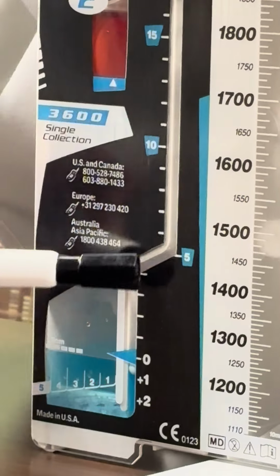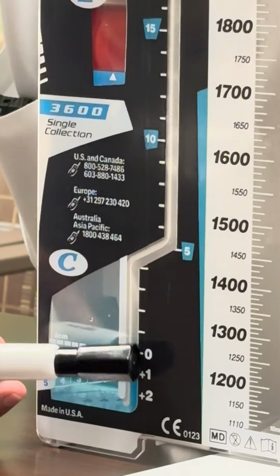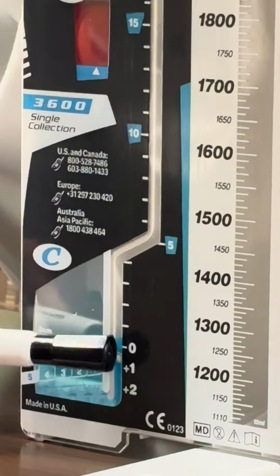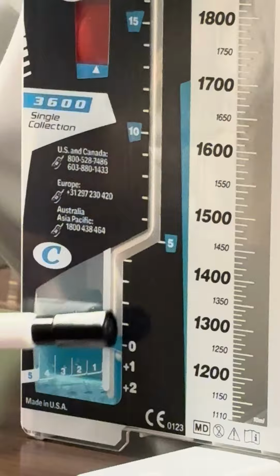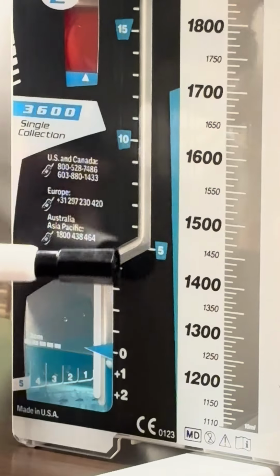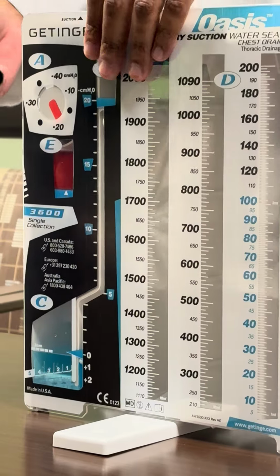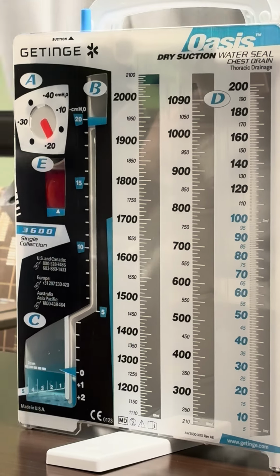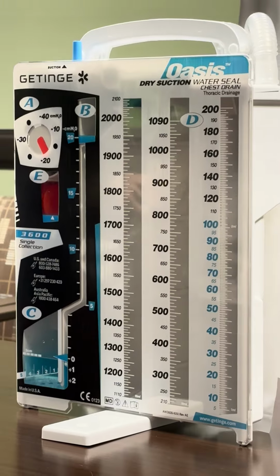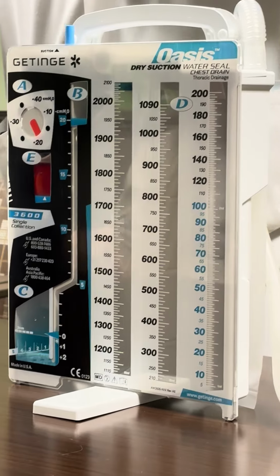Also make note of the intrathoracic pressure here. So I told you that with normal spontaneous breathing, you should have just a little bit of pressure right here, a little tidaling, maybe 2-3 centimeters of difference here, as opposed to somebody who has a high intrathoracic pressure. Issues that would cause that: number 1, somebody with a lot of air trapping, so somebody with asthma, COPD, who had a pneumothorax from that.